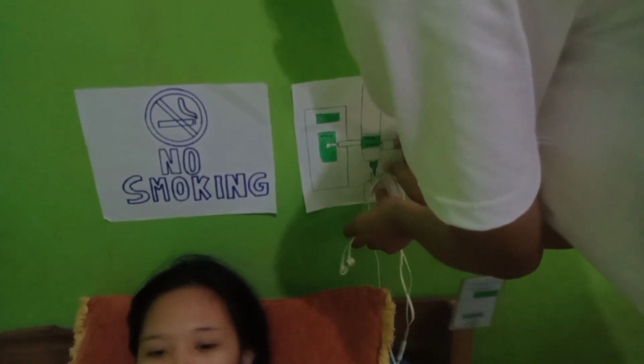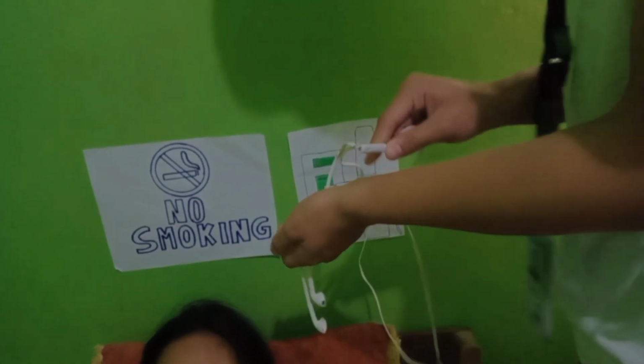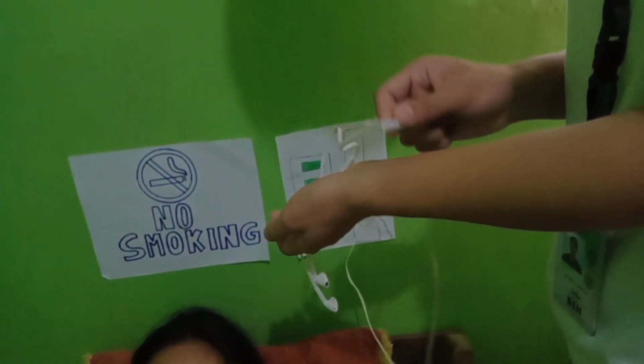Turn on the oxygen at the prescribed rate. Check that oxygen is flowing through tubing. Oxygen must be administered as prescribed.